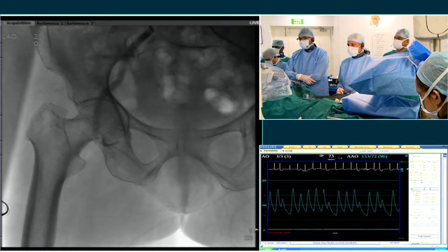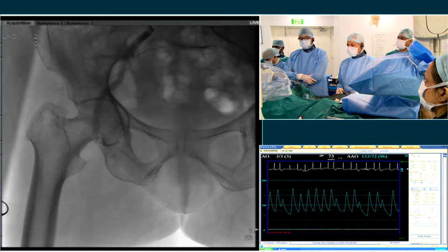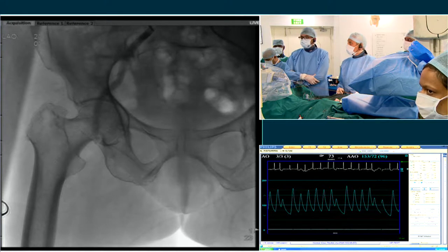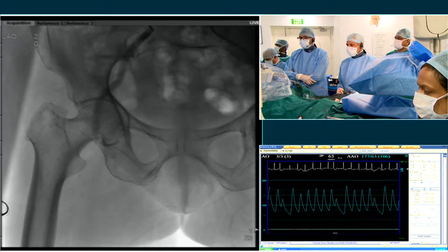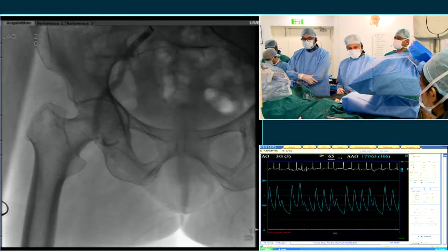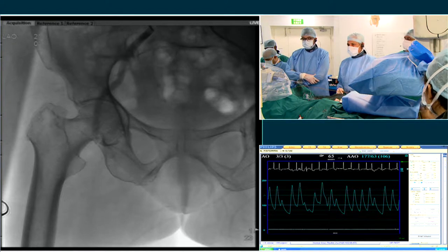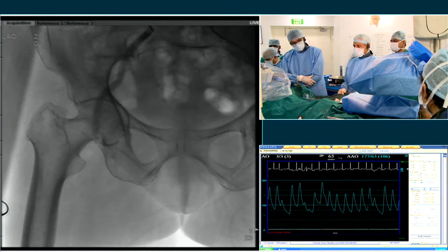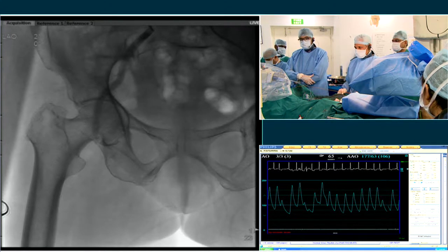Correct. Another point, what we are generally bothered about in India is that the choice depends upon the femoral artery sizes, because with MyValve we are finding it challenging. If the artery is less than 6.5, we can't do it, because it's a bigger French size. Whereas it may not be a point with Edwards, which is equally okay, but that is the other deciding factor in our country. I think we can proceed with the case, Susheel.